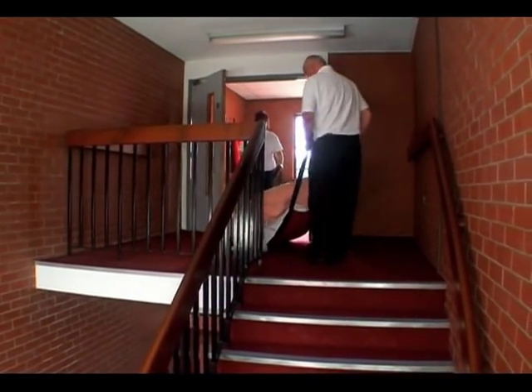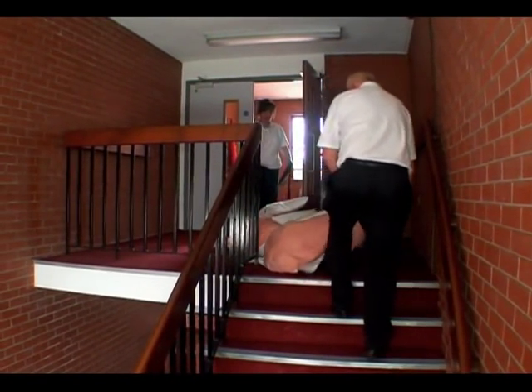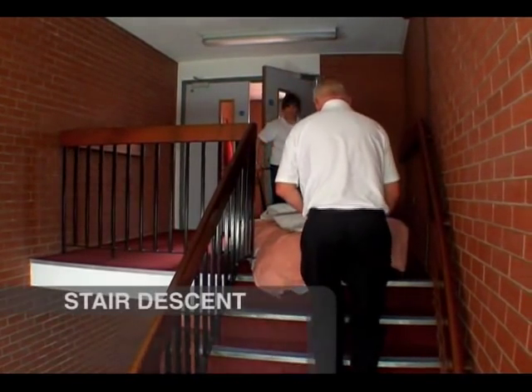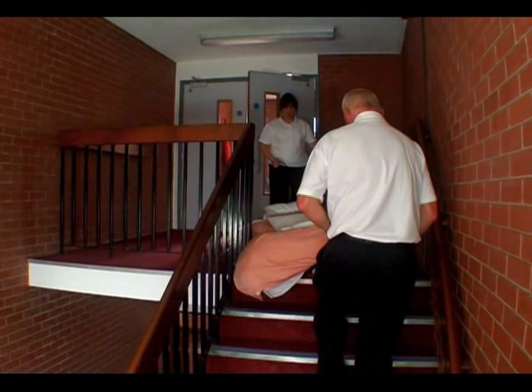However, please bear in mind that you need to arrive at the top of the stairs with the patient or resident feet first onto the staircase. When moving the mattress down the staircase, the person at the bottom of the ski sheet should use their feet and legs to assist their pulling action by pushing them into the stairs as they descend and pull the mattress.